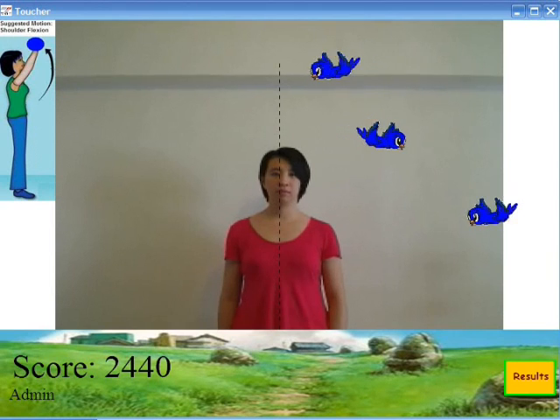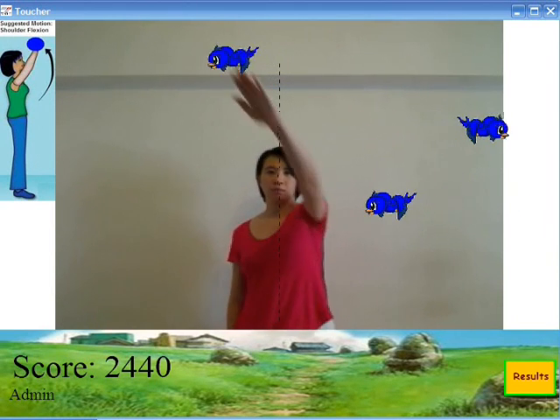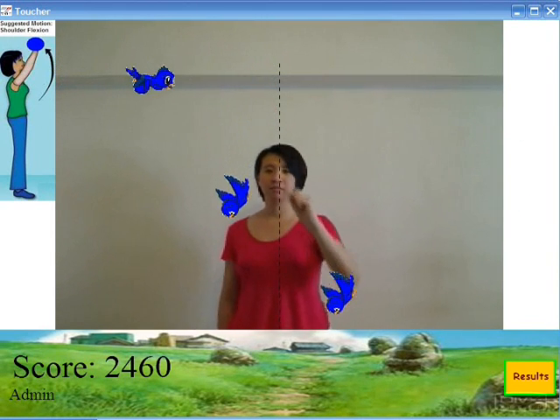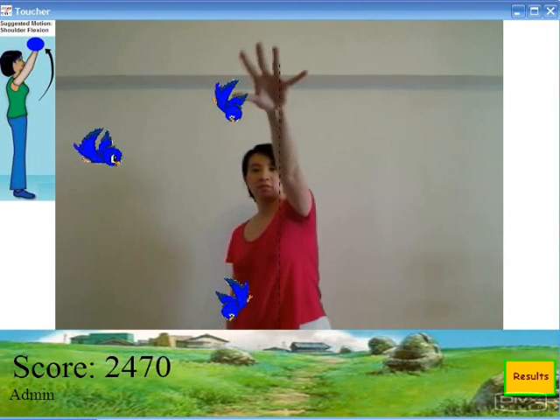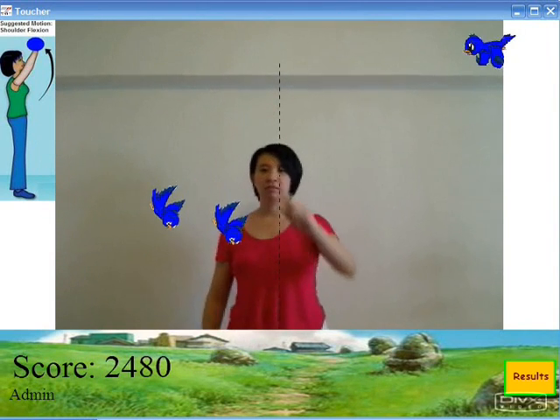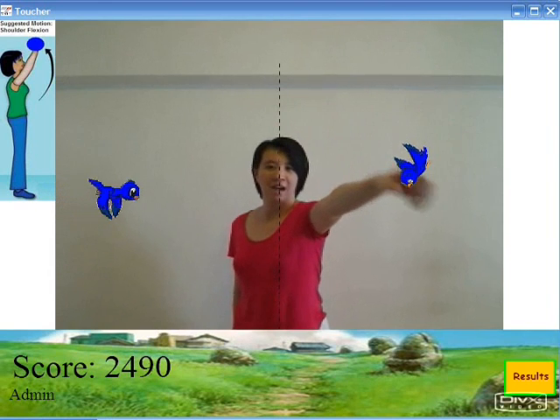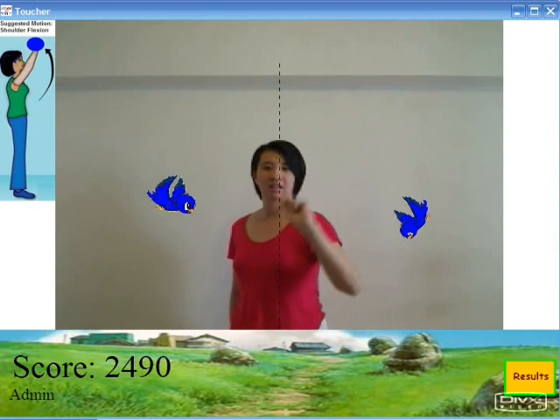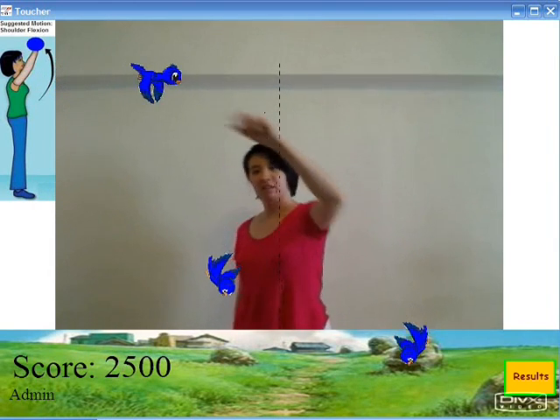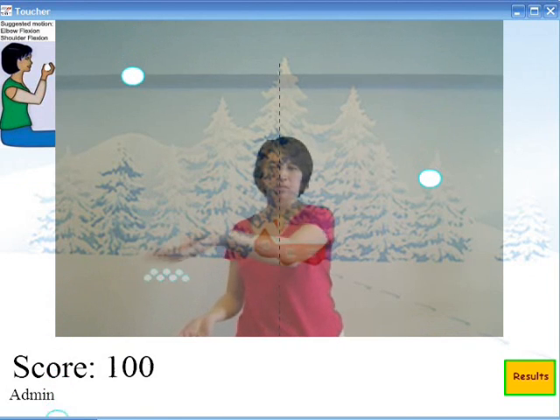The Virtual Reality Rehabilitation Software Toucher adopts the latest computer graphics and imaging technology. Patients are placed in a virtual environment to experience different visual and auditory stimuli. In addition, the virtual scene can gently guide the patient in a specific motor task.